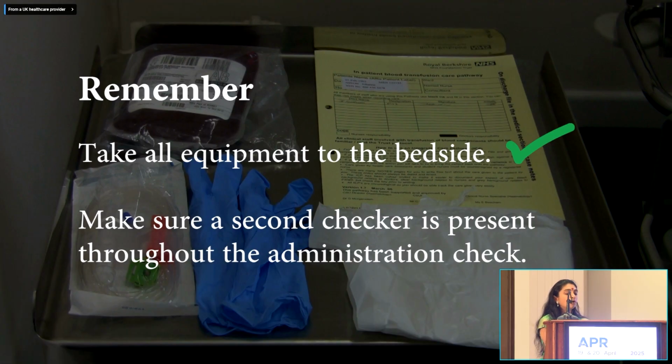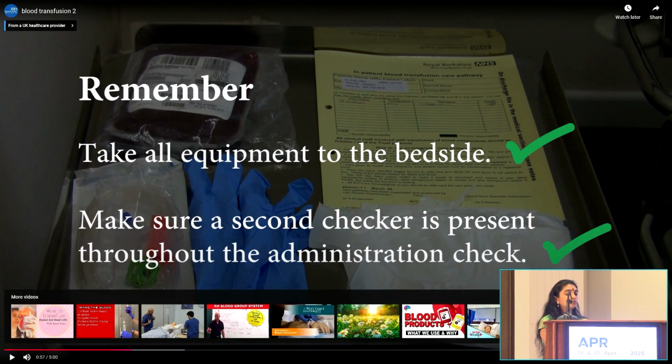After getting all the paraphernalia ready, we should cross-check at the bedside of the patient whether the blood bag received by the hospital is exactly matching the patient credentials.